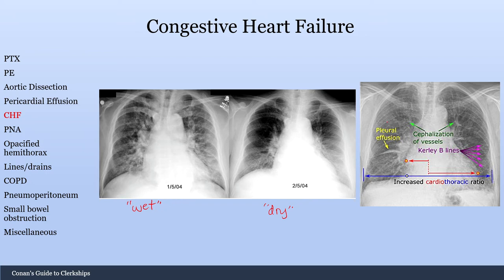Here are some common findings you'll see with CHF. Pleural effusions are very common, both within the lung fissures and at the costophrenic angles. Cephalization of vessels means the vessels going superiorly are thicker than those going inferiorly — not a normal finding. This occurs because ventilation is poor at the bases due to fluid, so perfusion shifts toward the superior parts of the lung.